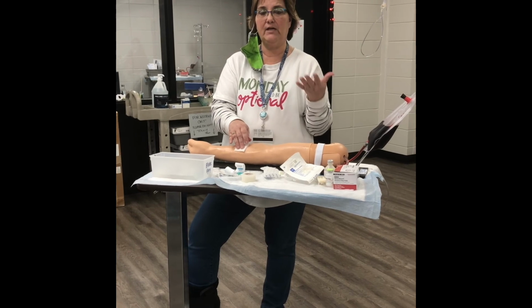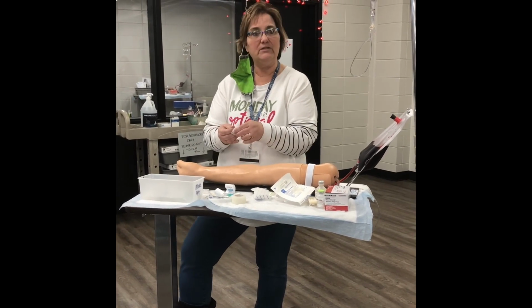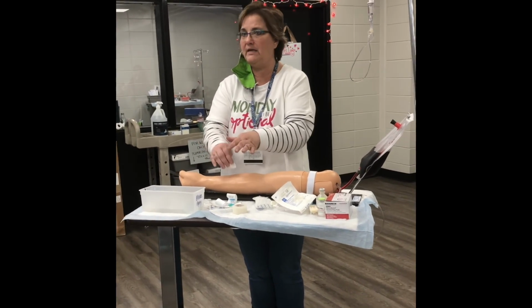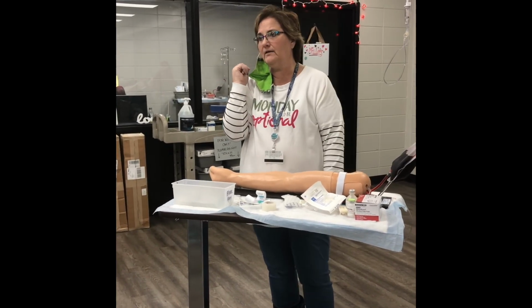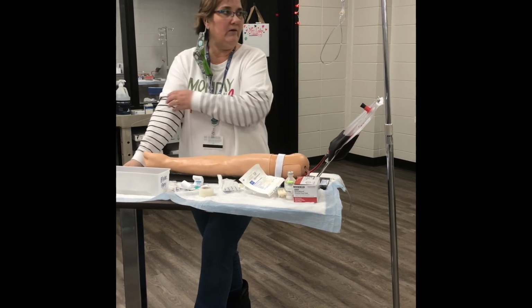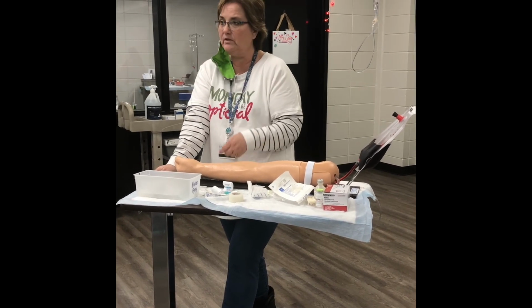If you take Coumadin, you may stand here 5-7 minutes before it stops bleeding. If my son is your patient who's 25 and healthy, you may stand there 15 seconds and it'll quit bleeding. And then put whatever kind of Band-Aid or tape your cotton ball down or whatever you're gonna do. Having them hold their arm like that till it quits bleeding is not okay, because if they put their arm down after you leave the room and they get a big old hematoma, who's gonna get in trouble? The patient? Mm-mm. So just hold pressure till it quits bleeding.